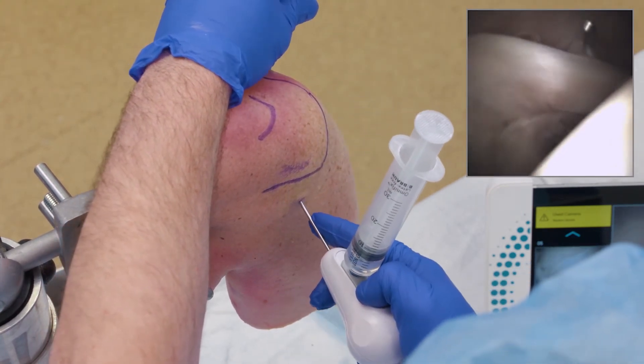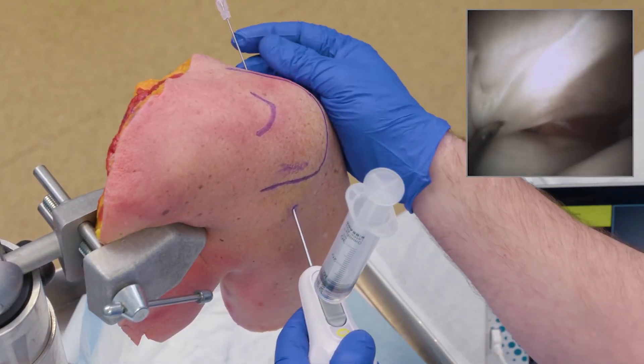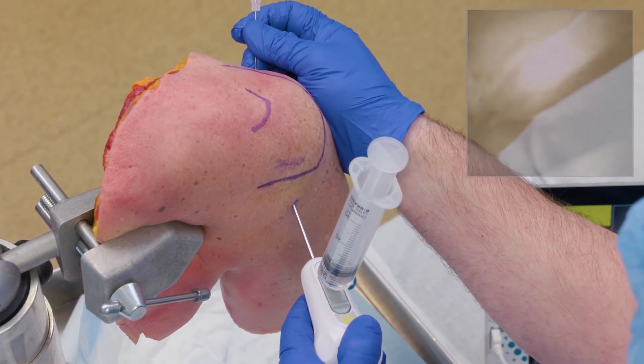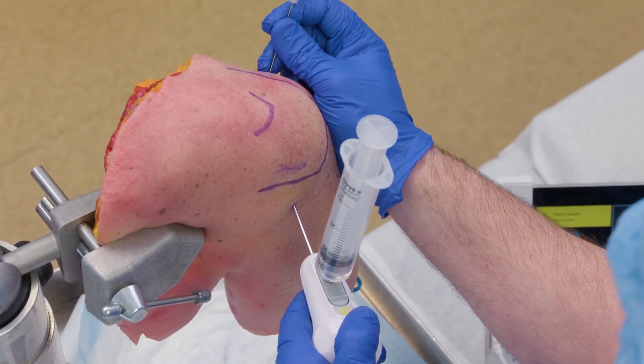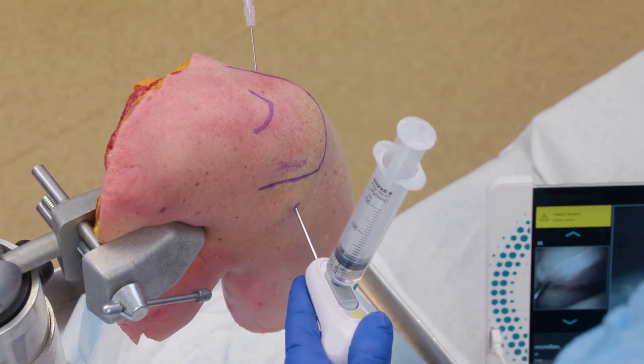I can also check for some stability as my biceps goes down over top into that sheath. This gives me a way to be inside the shoulder joint and palpate all the structures I need in a non-painful, non-traumatic way just by using an 18-gauge needle. Driving that optic source right up to that rotator interval allows me to get in reproducibly without much discomfort.